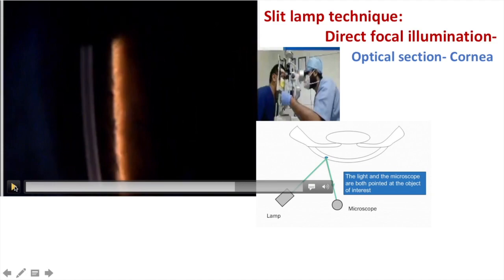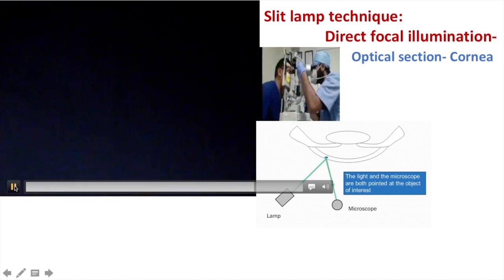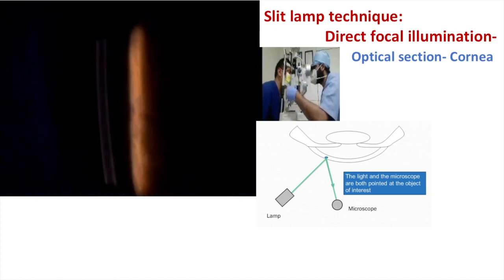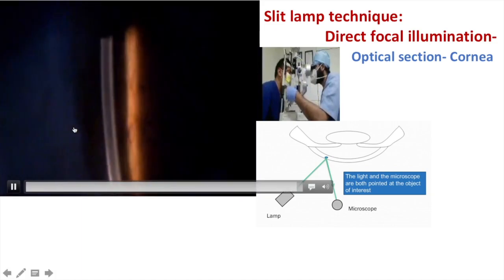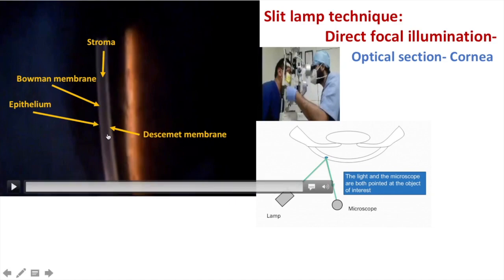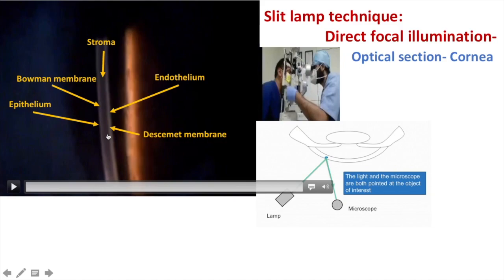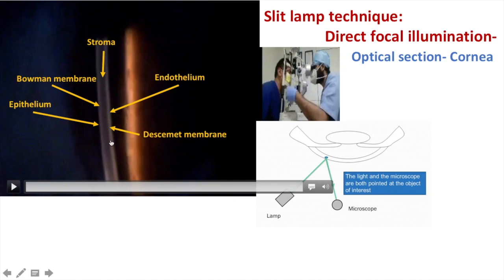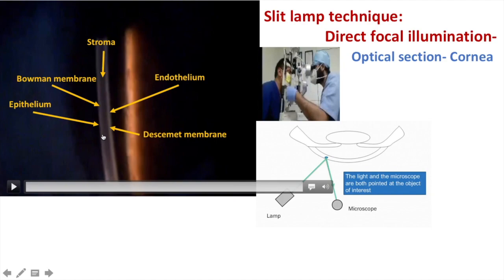Let us see what layers we can appreciate in this high-magnified view of the cornea. You can see a thin bright light — that's the epithelium. Then is Bowman's membrane, then the stroma matrix, then a band which is Descemet's membrane, and the last layer is the endothelium. The pre-Descemet's membrane will not be seen as it is Dua's layer, which is surgically more important. By making this slit in any part of the cornea, we can know which opacity or dystrophy or degeneration is present in which layer.